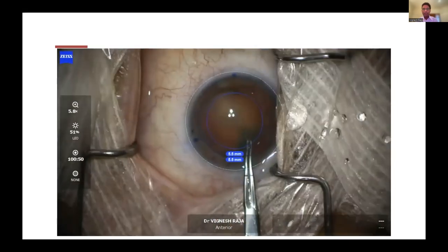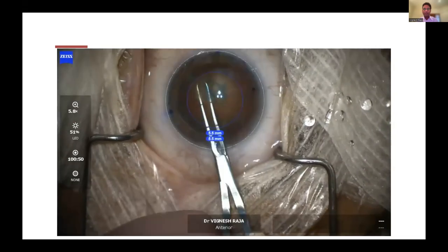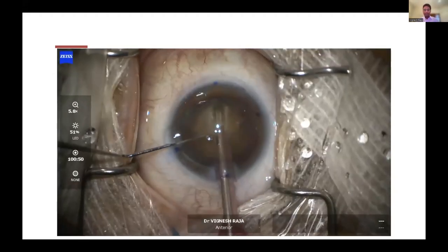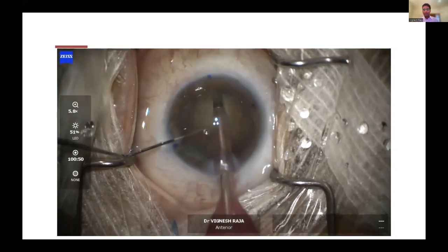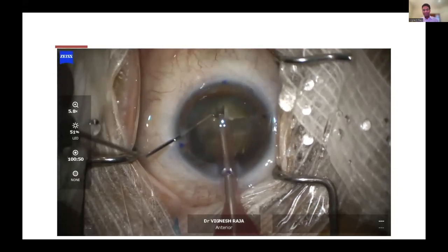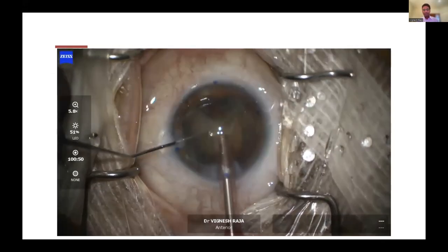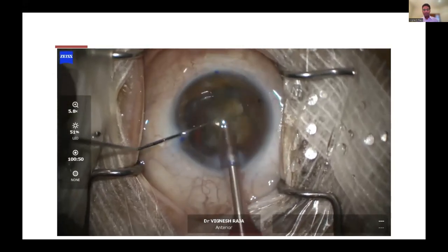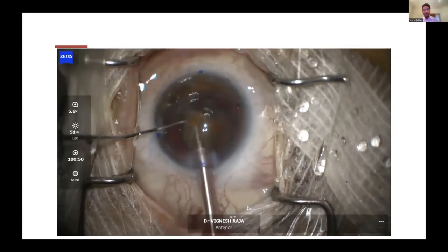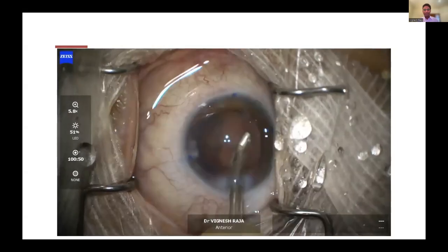So I'm using a Callisto-guided 5.5 millimeter rhexis, so that we can get a nice circular rhexis to implant it in the bag. I still do good old divide and conquer or stop and chop. I'm not a fancy chopping surgeon. So I proceed with straightforward cataract surgery. As you can see, the cataract is quite dense. I just sped up the video because in India, I'm sure we do much more complex cataract surgeries than these. So I'll cut to the chase right now.